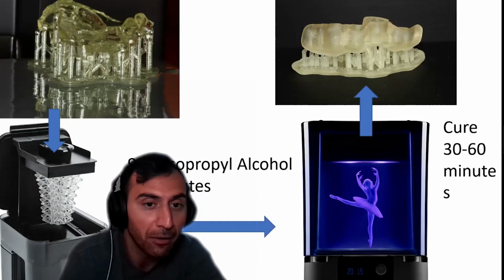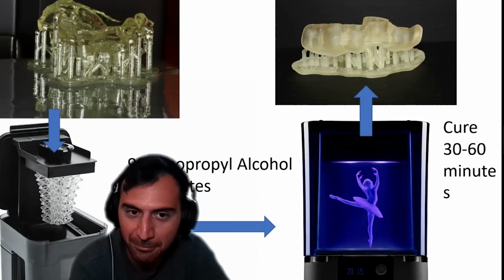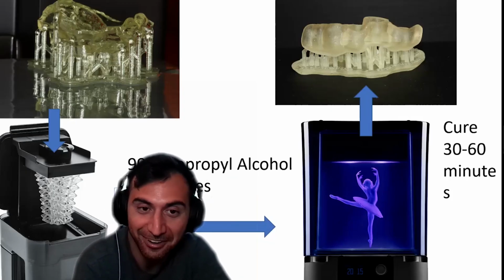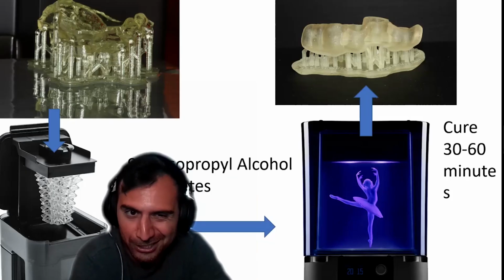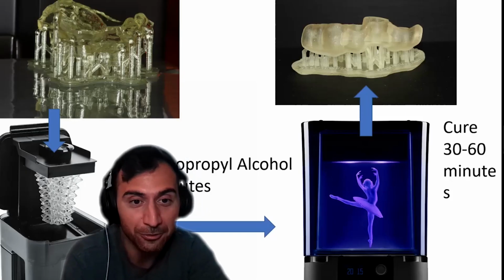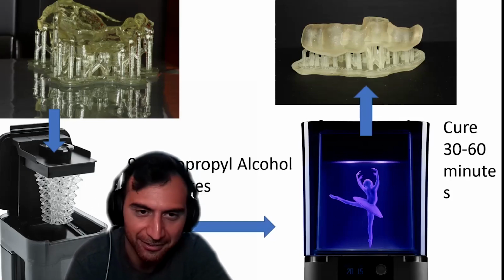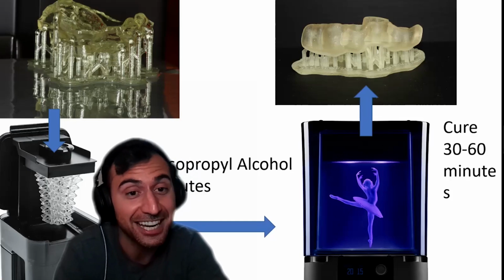Again, I used to use a nail polish curing unit that I bought on Amazon. I used to be really slim in how I operated with these things in residency because I didn't have a lot of money. So I was just trying to figure out ways to use it. And that's how I actually still practice a couple years out of residency. But now the ROI made sense that I bought the damn things to do this right and efficiently and delegate.